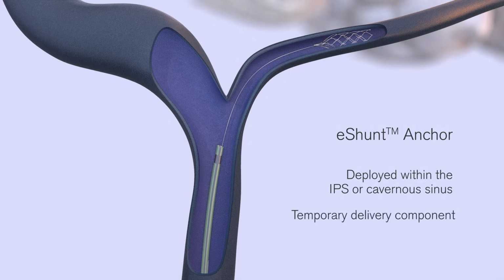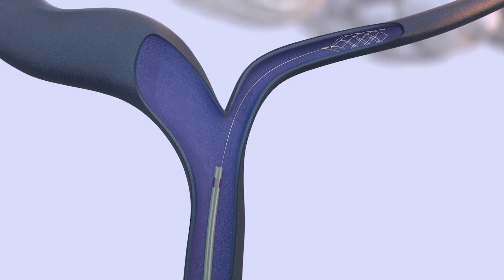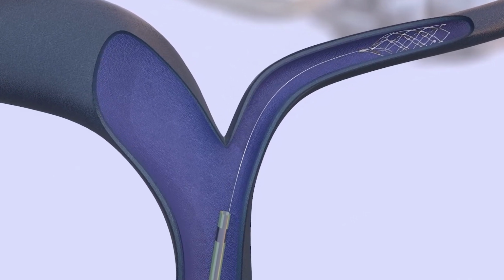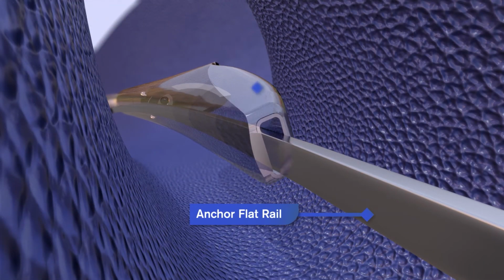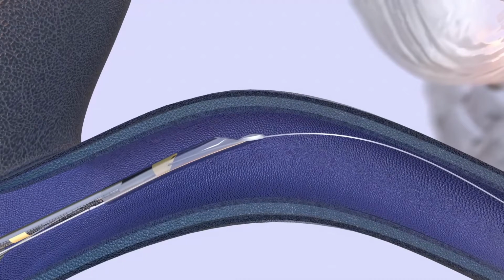The anchor is a temporary delivery component that is resheathed by the microcatheter and removed after e-shunt implant deployment. The e-shunt delivery catheter is configured to receive the flat rail within a dedicated rapid exchange lumen and is advanced into the patient over the flat rail, through the venous vasculature and into the IPS.